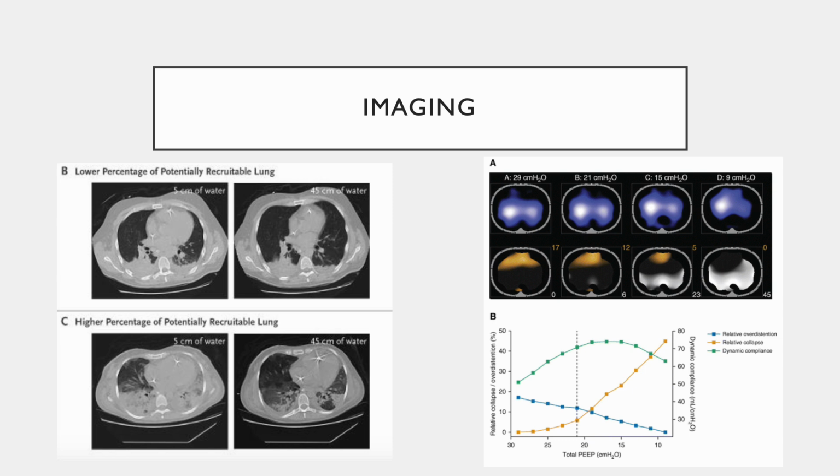Finally, a variety of imaging-based methods of assessing lung recruitment at different PEEP levels have been studied. CT scan, electrical impedance tomography, and ultrasound modalities are such examples. Arguably, these imaging methods may provide more direct means of measuring actual recruited lung volume compared to lung mechanics-based measures. Regardless, limitations still exist for each of these modalities. Some methods like CT-based approaches are logistically impractical and are hence confined to the realms of research. Tools like EIT and ultrasound may prove to be more feasible. However, we await more clinical studies to determine actual benefits.